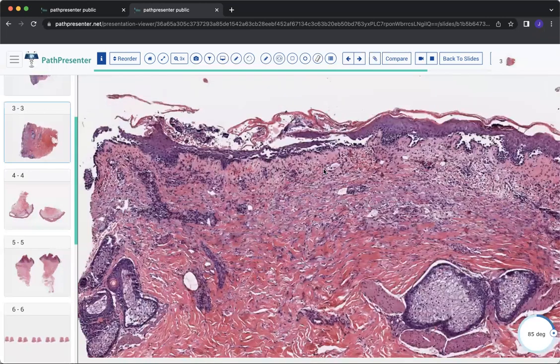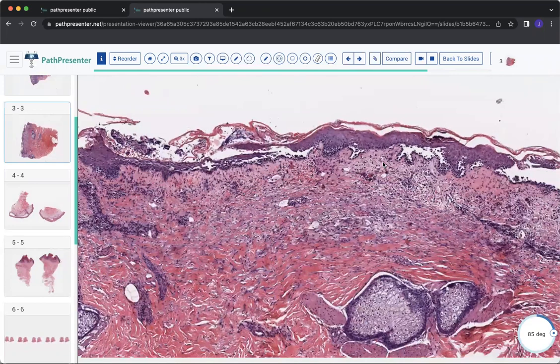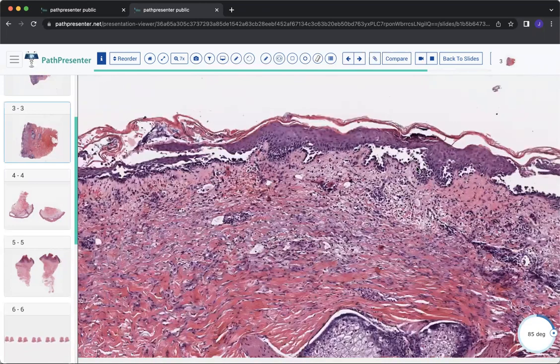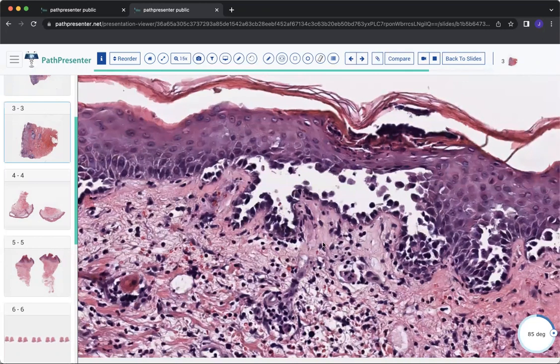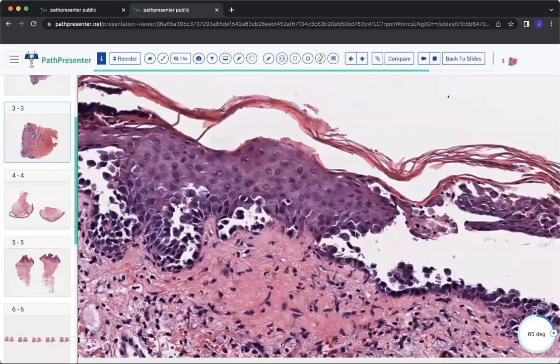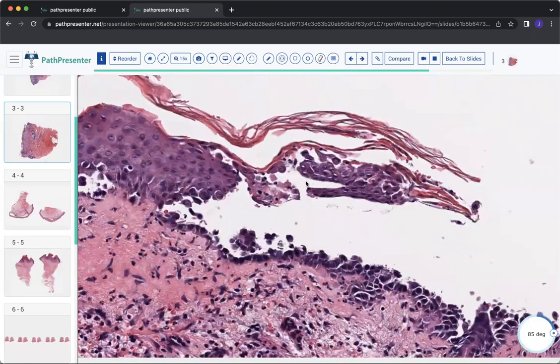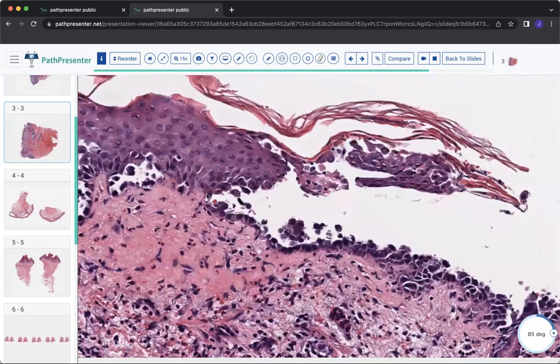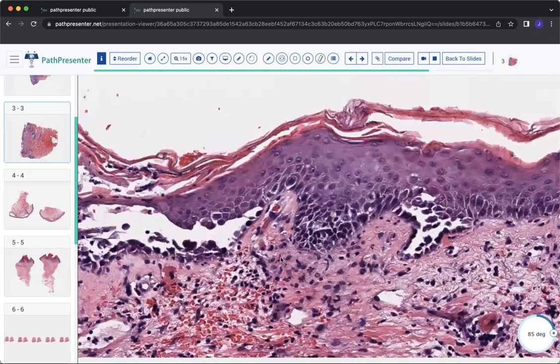All right, so you see a punch biopsy. The defect mostly seems to be, actually, your eyes probably jump to this area here where it looks very similar to the last example. You have some areas that look like tombstoning. The keratinocytes are definitely breaking apart. And you can see over here that the keratinocytes are breaking apart at different levels. So you've got near the basal layer, you've got close to the granular layer, all kind of throughout all layers of the epidermis here, as you can see.